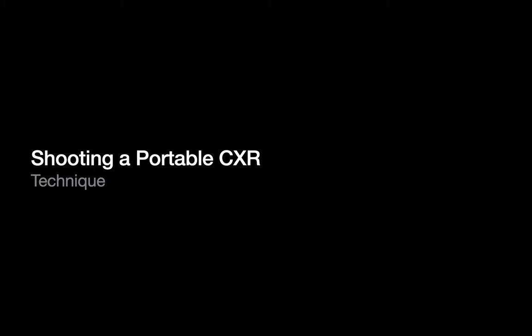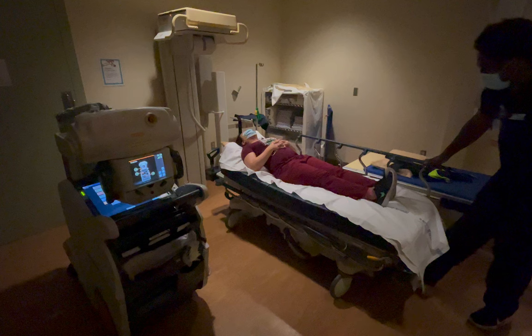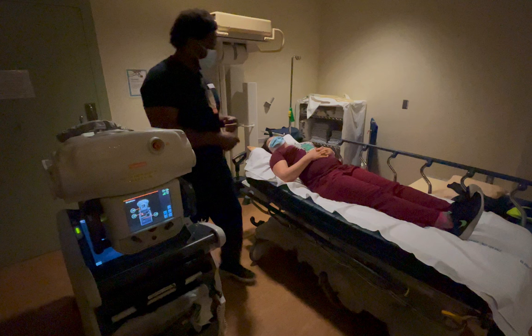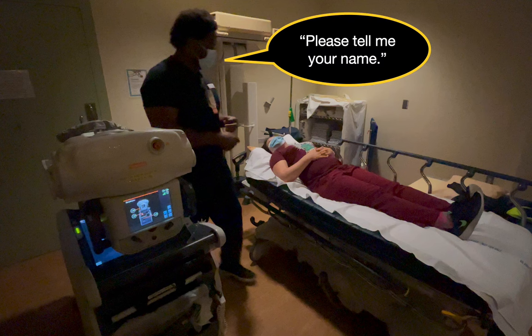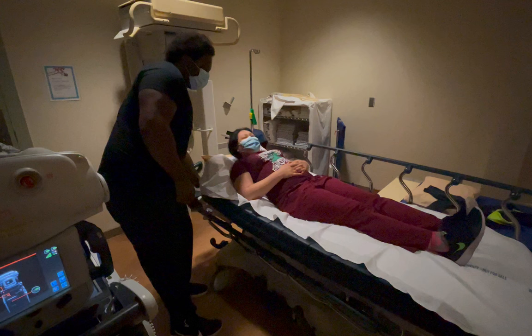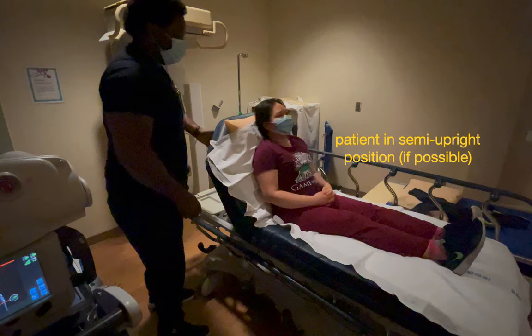When it's time to shoot a portable chest x-ray, the x-ray tech will push this entire portable x-ray unit in its stowed state to the patient's room. The patient will usually be lying on a gurney. After saying hello and introducing themselves, the x-ray tech will confirm that they are about to x-ray the correct patient by asking the patient two different questions to confirm their identity: their name and their date of birth. Once the patient's identity is confirmed, the x-ray tech will try to raise the head of the bed and place the patient in an upright or semi-upright position if they can.